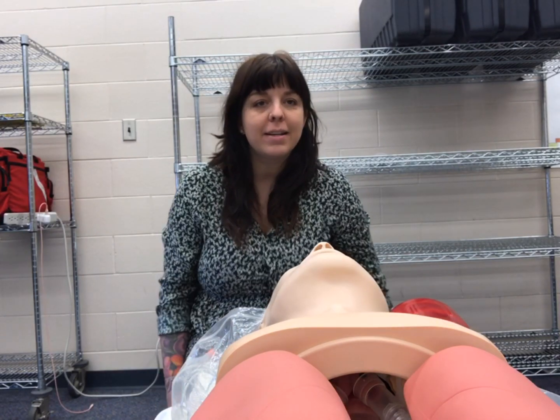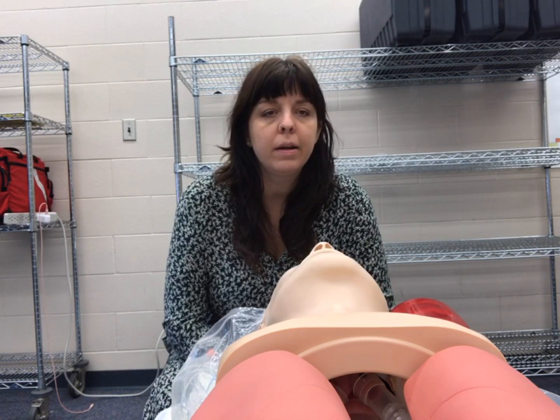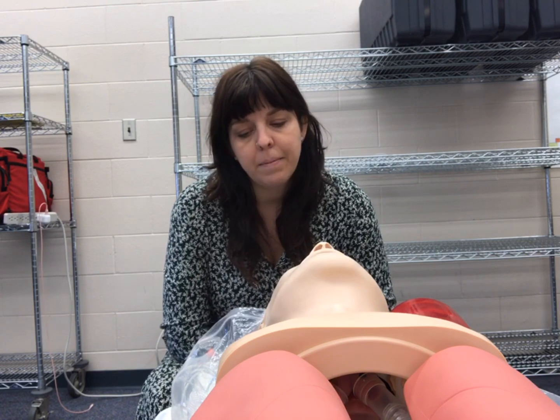Good morning everyone. I'm going to discuss the failed airway approach and go through the steps with you. When we have someone who's alive and their SpO2 is decreased — by decrease I mean under 85% — we need to act. In this case, I'm going to show you how to use a bag valve mask on someone who is unconscious, and walk through the progression and decisions you make to improve SpO2 above 85%.